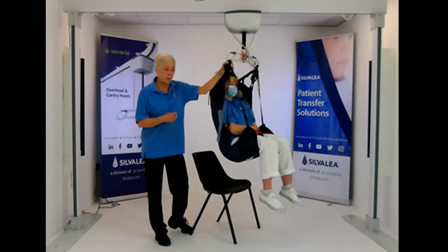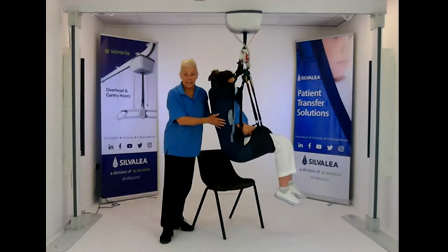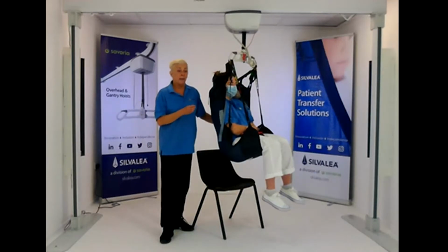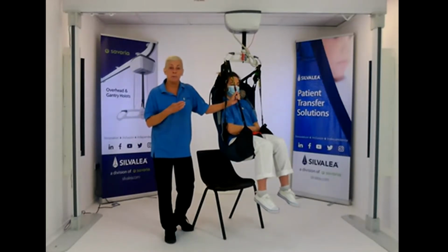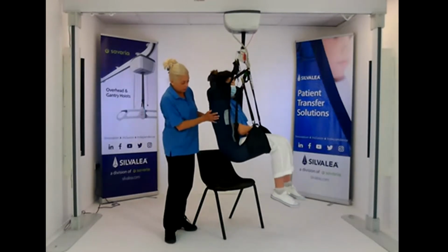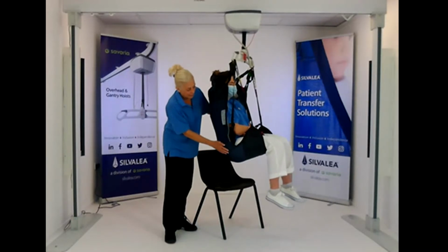And I know we did sort of touch on in situ. We make it as smooth as we can. So in situ slings, we look at the tailoring. If they're going to be left in for extended periods, then we're conscious to remove any bulk. There's no handles, so there's no risk of any pressure. It's as smooth as we can.